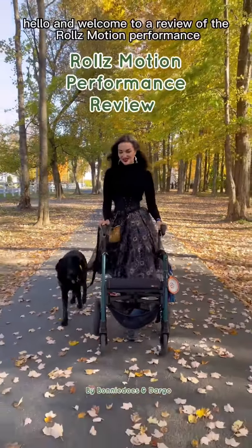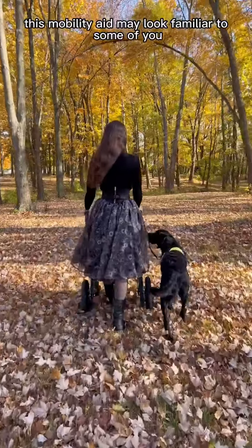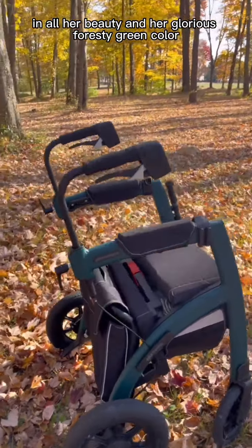Hello and welcome to a review of the Rolls Performance. This mobility aid may look familiar to some of you — it's an air tire version of the Rolls Motion 2. Here she is in all her beauty in her glorious foresty green color.